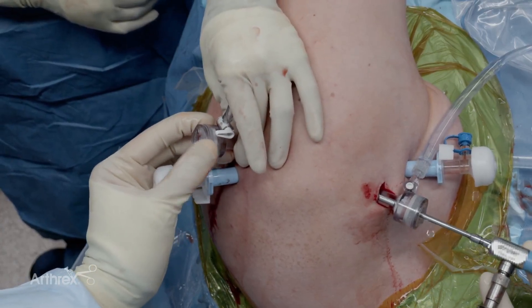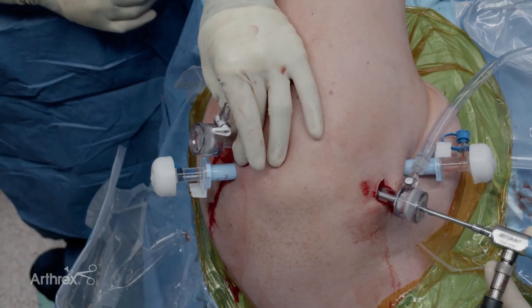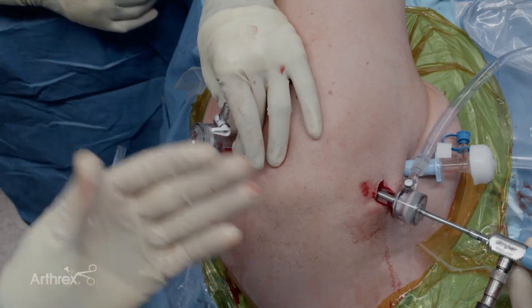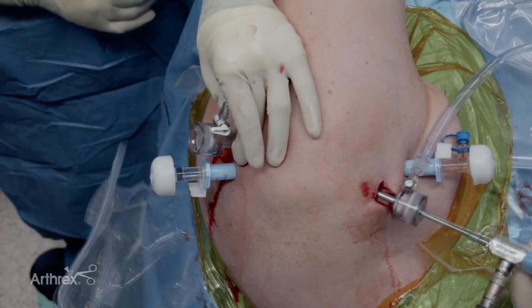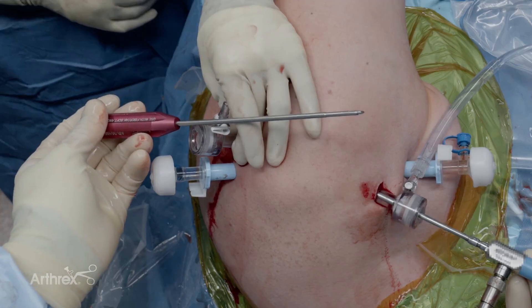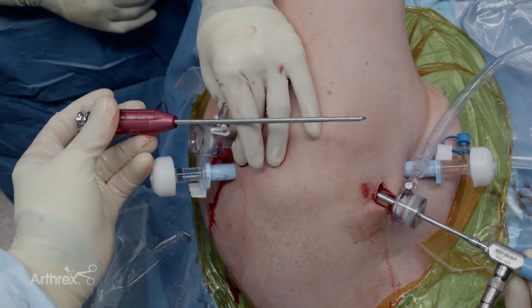I'm first going to insert my inferior anchor. You want to insert the inferior anchor first because once you insert it, it becomes difficult to see the superior anchor. I use a 1.8 millimeter knotless fiber tack anchor. I'll insert with a sharp guide to penetrate through the posterior tissue.